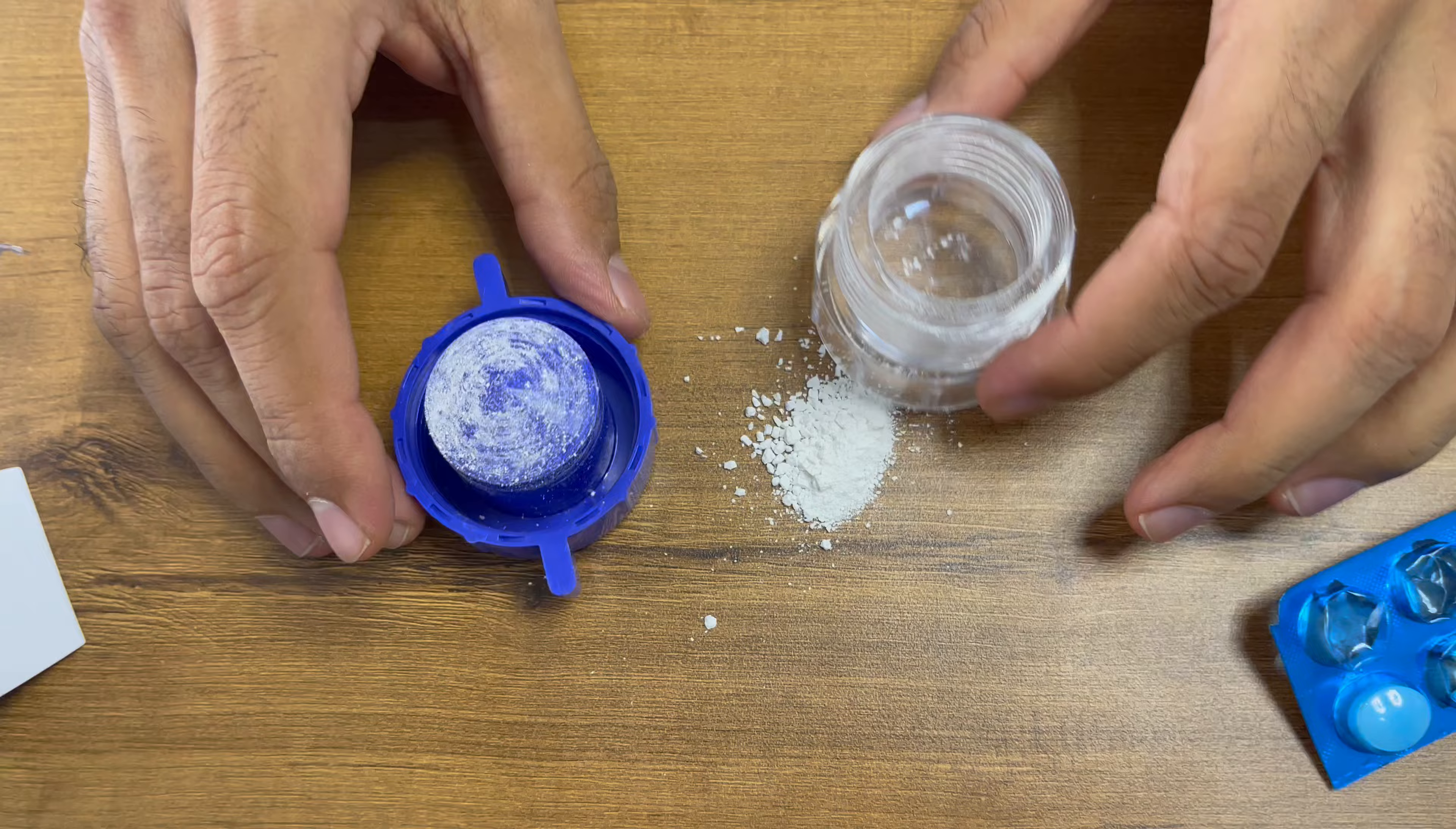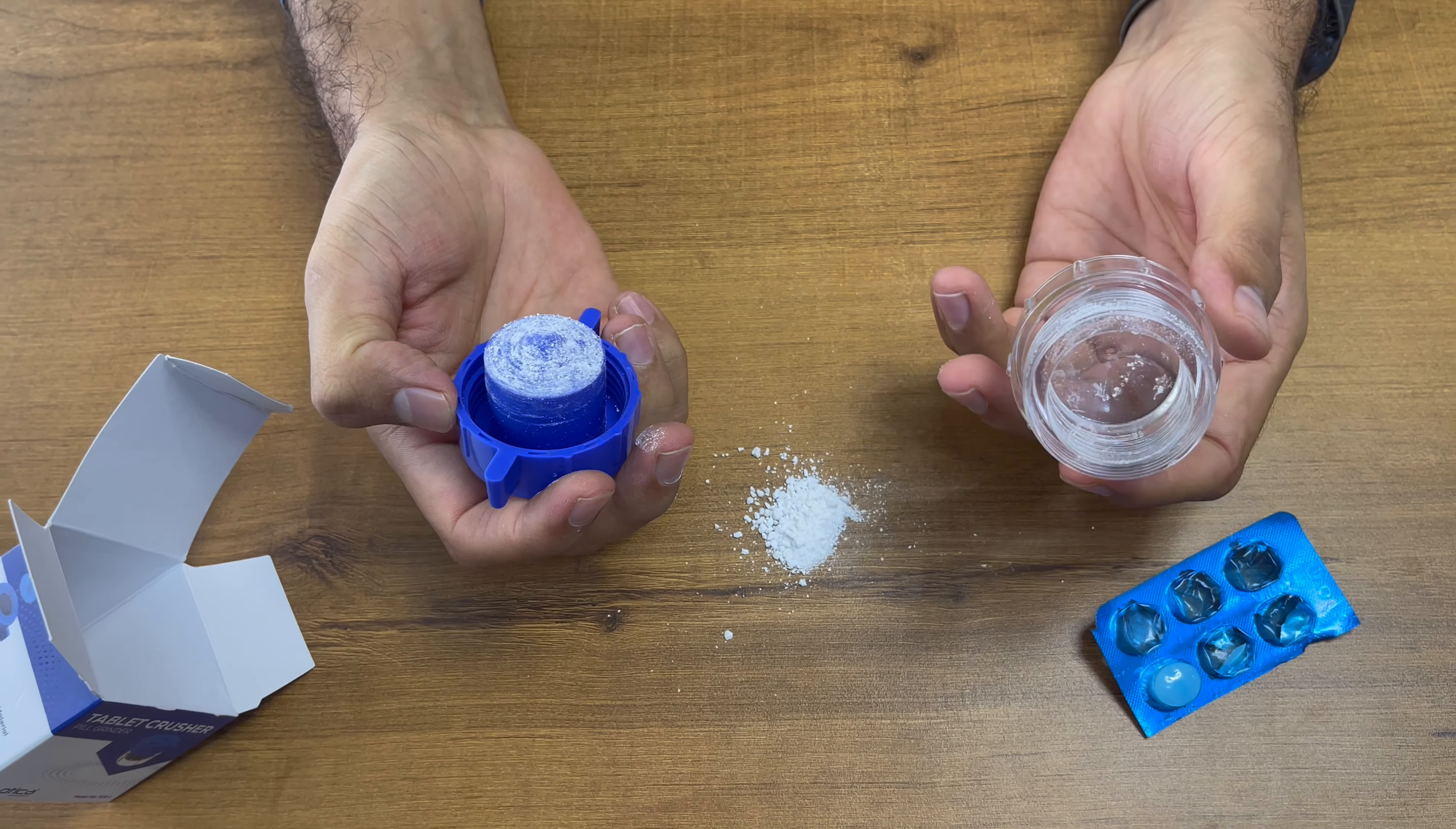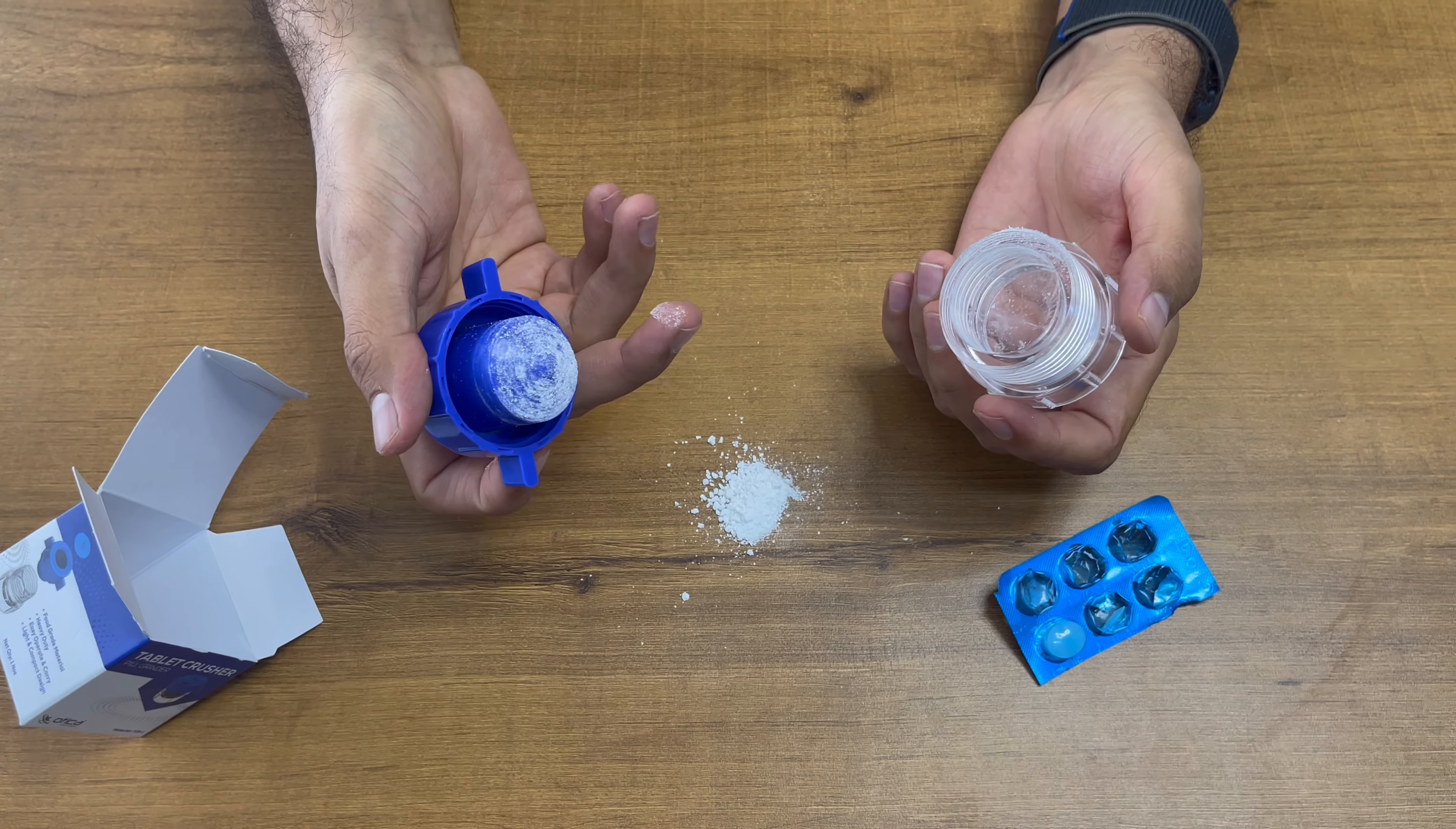You can use this device like this - you can insert water inside and have it with your water, or else you can add this powder to any food for the patient. Thank you.